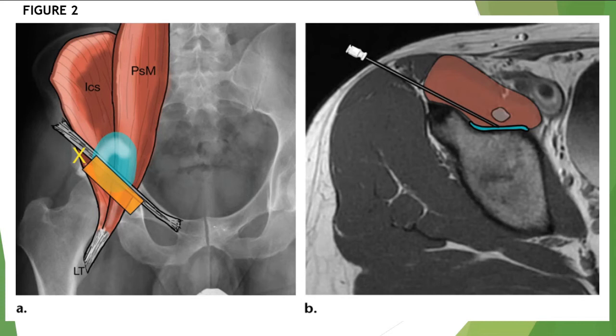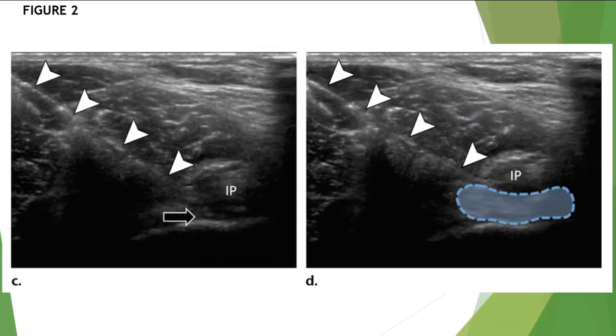So then to complement with ultrasound images, you have here in image C an ultrasound image that's oriented transversely relative to the iliopsoas tendon, and it's showing the needle with the arrowheads, and you can clearly see its tip, which is here marked by the arrow itself. It's just lateral and deep to the iliopsoas tendon, which is here marked by its initials, and it's abutting the underlying ilium. So it's just touching and taking contact with the ilium, the bone surface.